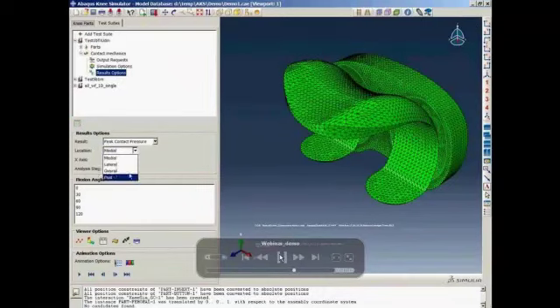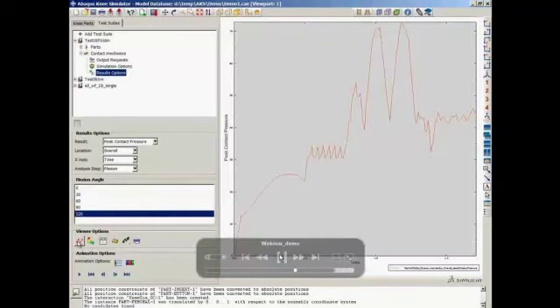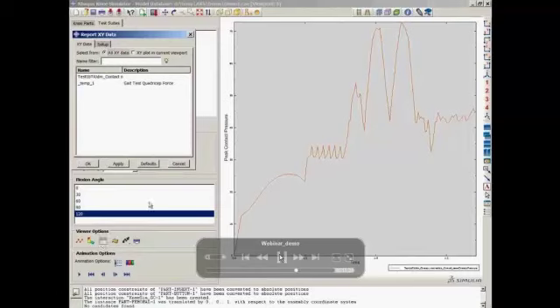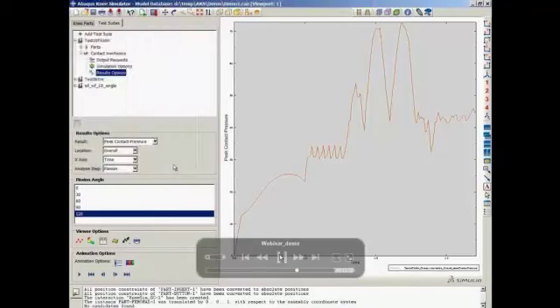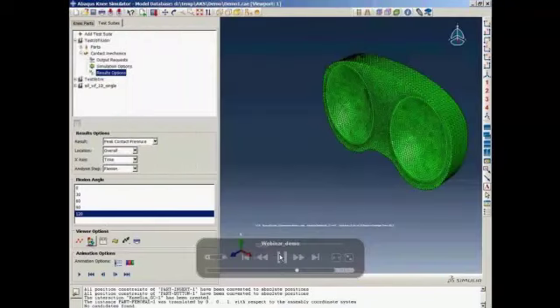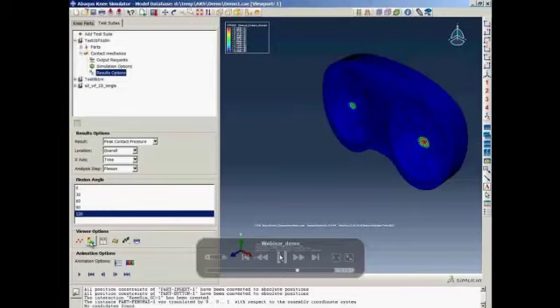The user can choose which results they would like to see in which area to be plotted against time of flexion, and they can choose whether they want to plot the XY plot. In the case of XY plot, they can also choose to report the XY plot to a text file. They can also create a contour plot for specific output. In this case, it's the contact pressure. And they can visualize the progression of contact pressure or any contour outputs over time using the animation button.